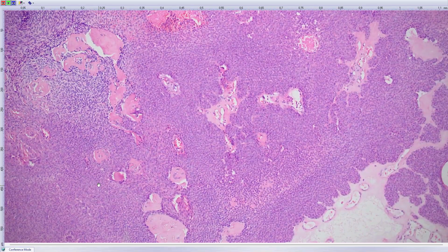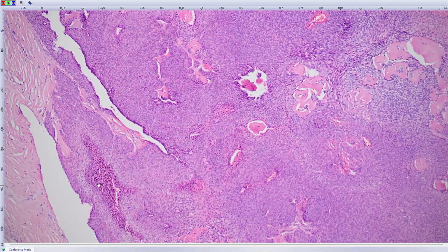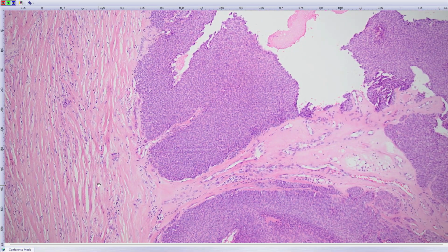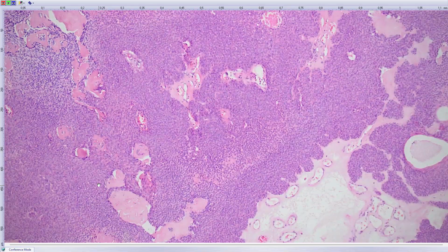The tumor was YAP1 negative, that means it was YAP1 deleted staining, and NUTM1 positive, which is typical for poromas and poroid tumors. Yeah, it doesn't say anything about malignancy. I think it's a low-grade, probably benign tumor. Yeah, I've very rarely seen malignization of these tumors. Yeah, just this immunoprofile fits very nicely to this classification.